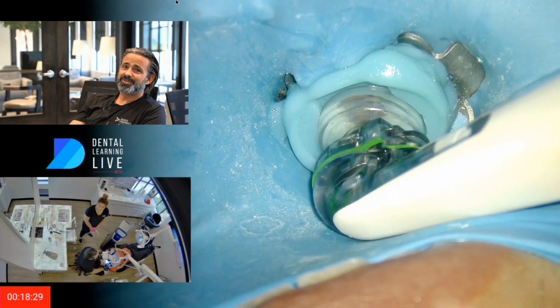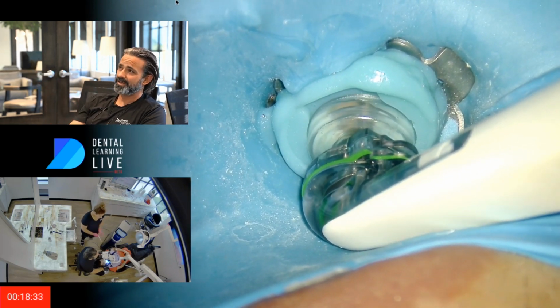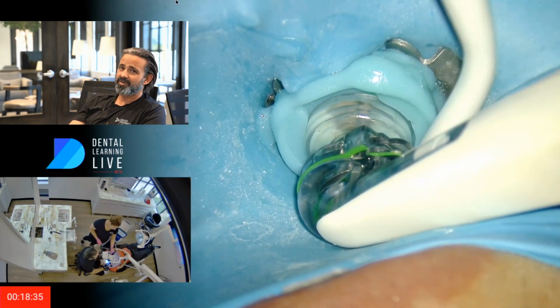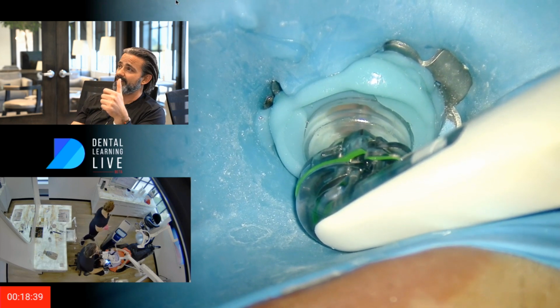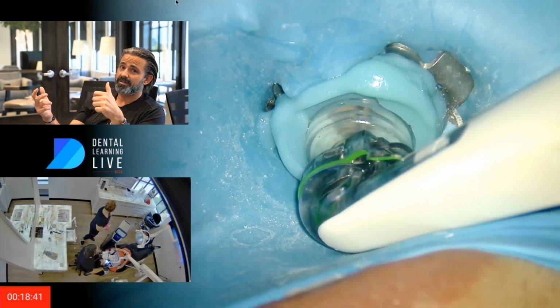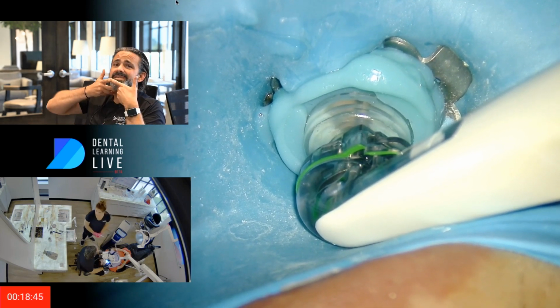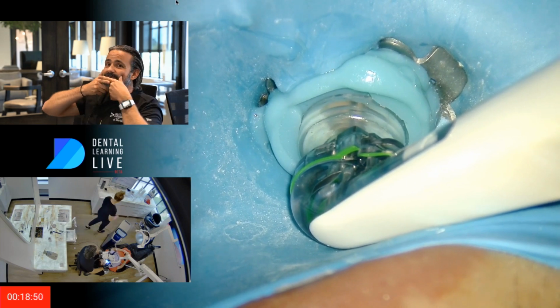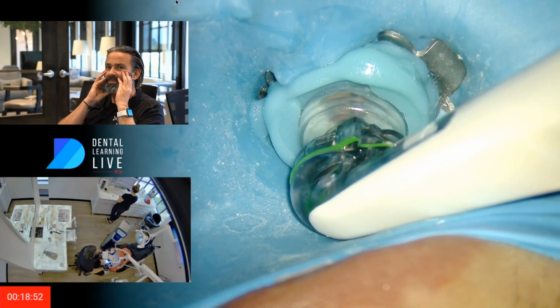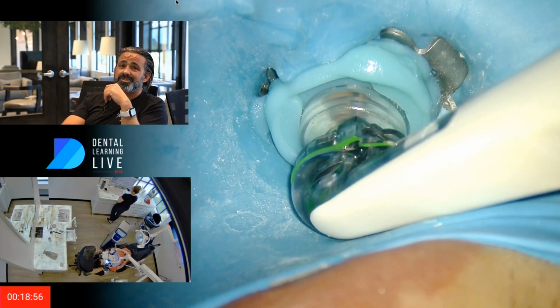A lot of times during this time, if you look in the bottom left-hand part of the screen at what Lindsay's doing, I have her on guard on suctioning because of his movement. And you'll also see my left hand, since I'm right-hand dominant, just resting my thumb on top of it, because I'm actually holding under his chin. So when he moves, I'm moving with him like this. It's not force. I'm not holding him in place. I'm just going to follow him with two hands because I got sick of dislodging that.